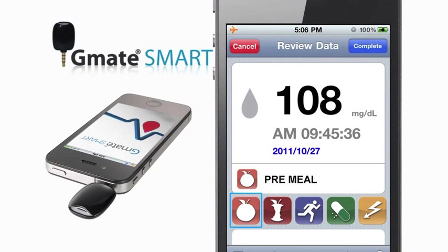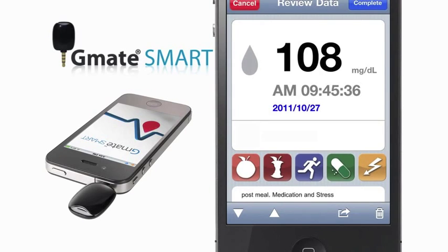Note icons include pre-meal, post-meal, exercise, medication, and stress, or you can simply type a custom comment.